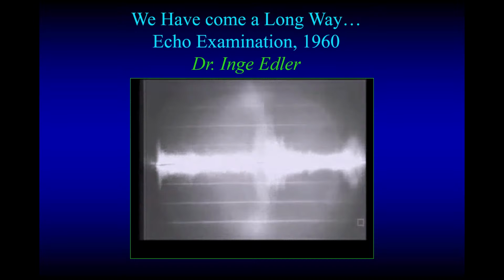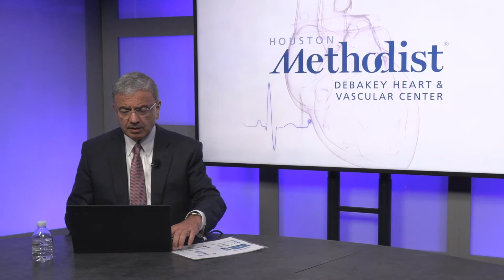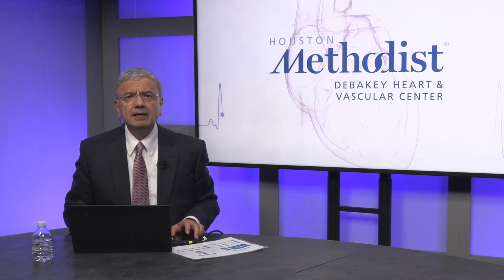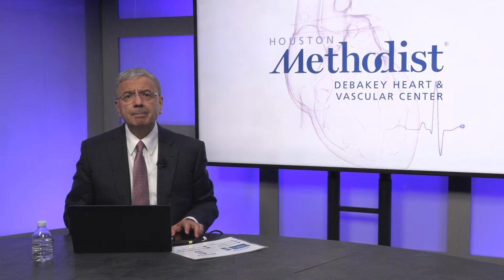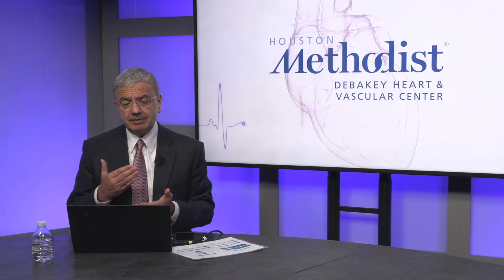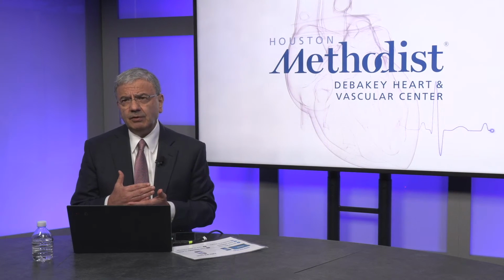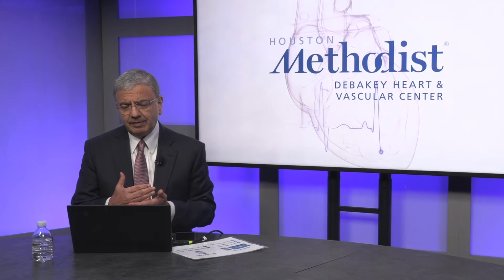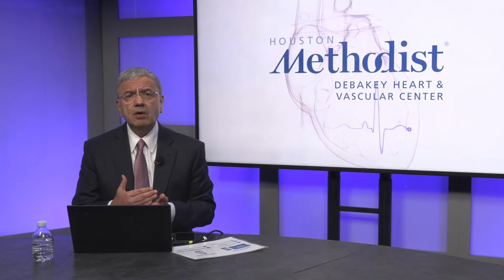So thank you very much for your attention. And I know there may be some questions that you want to share with us. And I see here, why is the Nyquist limit half of your PRF? Because if you go through the physics, you have to at least have two samples per cycle to be able to detect the frequency shift that you're dealing with in ultrasound.